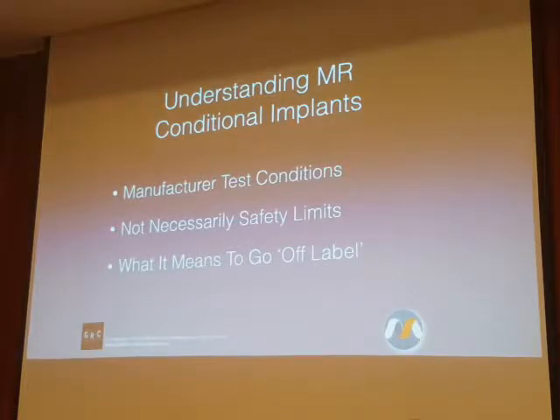So I can take my implant, my device, and I can instruct the place where the test is being conducted, I only want you to test this at 0.1 watts per kilogram of RF power, because I know I'm not going to have dangerous heating at that level. And so the site tests it at 0.1 watts per kilogram, and they say, guess what? There's no significant heating.